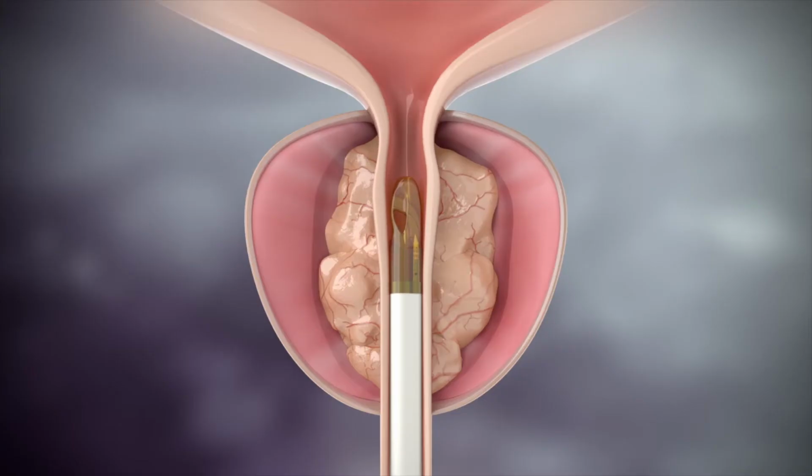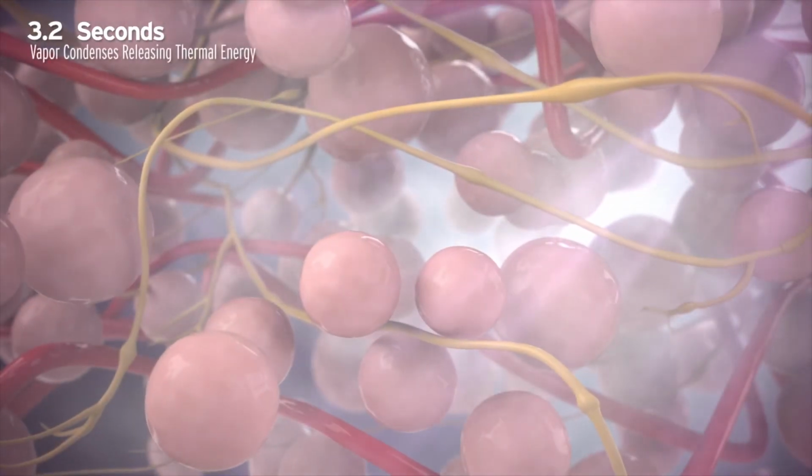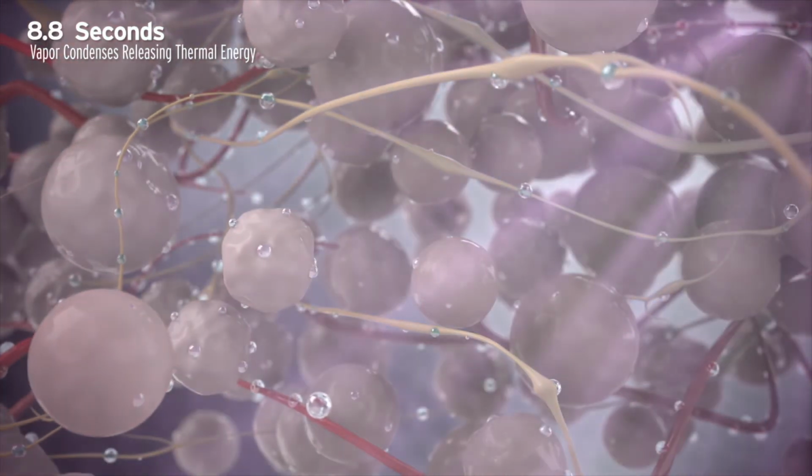The rate of infections is low. It's about the same as what's reported with the iTind. The discomfort after the procedure is tolerable. Most patients do not require much in the way of pain medications. There can be some discomfort during the procedure, but we've really honed in on the proper technique to make the procedure as tolerable as possible. And Rezum, again, involves steam, sterile water that is injected into the prostate, and that water vapor strips the cells and causes them to slowly shrink and go away, leaving a cavity.